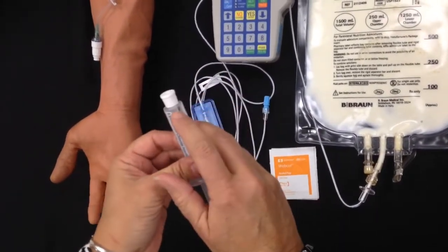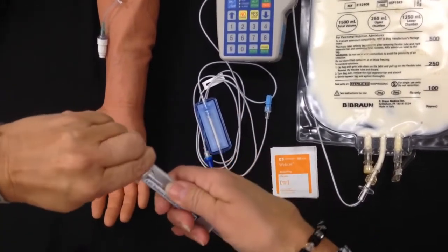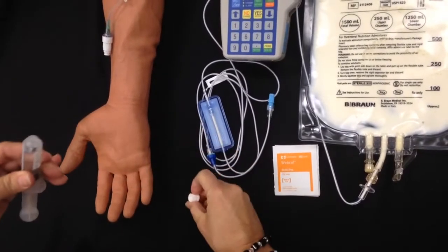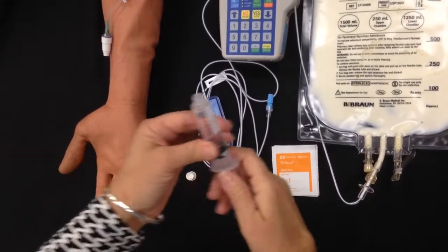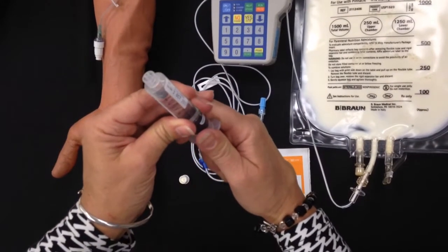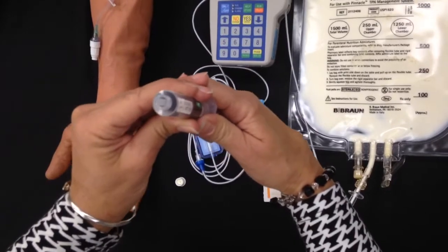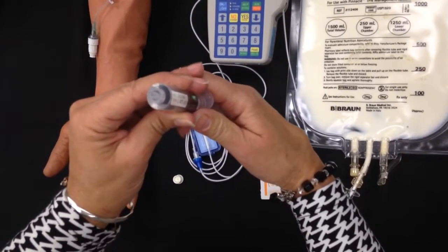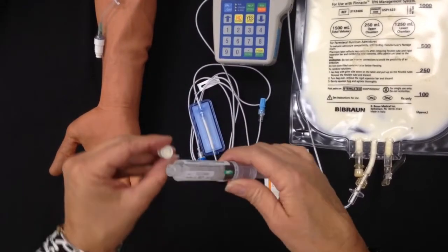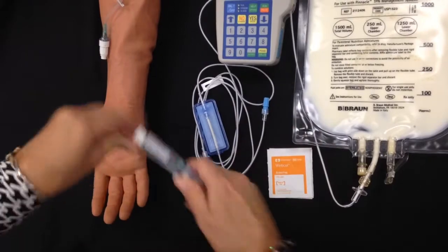There is a small air bubble in the syringe that we need to remove, so carefully remove the cap and set it upside down on the table without touching the ends. Pull back on your syringe just a little bit to break the seal and line that bubble up and push it out the top. You should see fluid come out the top. Carefully pick up your cap and recap.